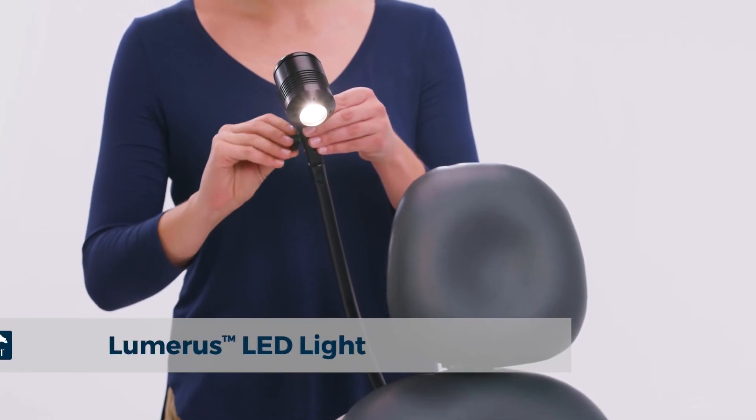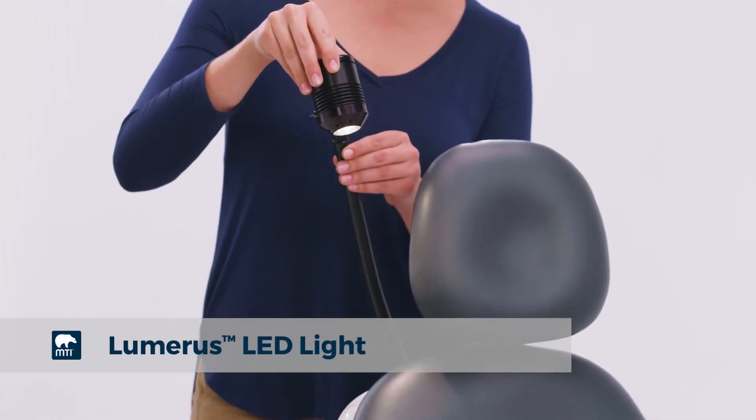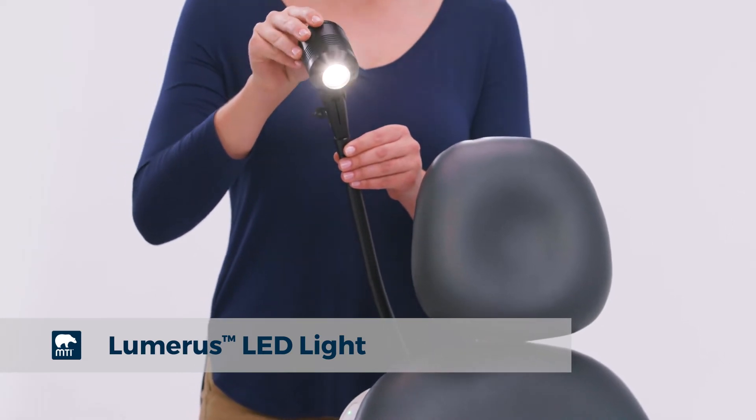MTI's Lumerus series lights are environmentally friendly LED lights used for examinations and minor procedures, available for mounting to any MTI chair.